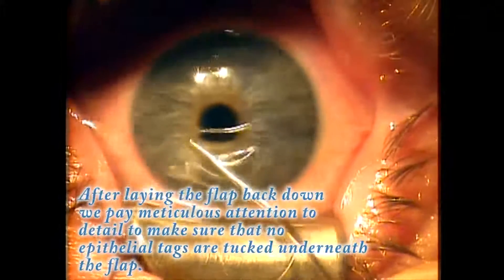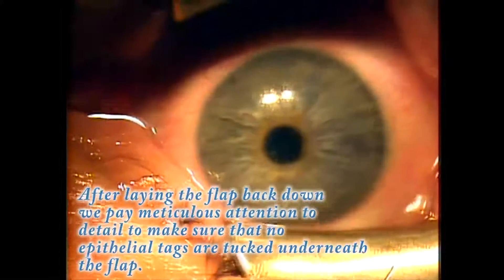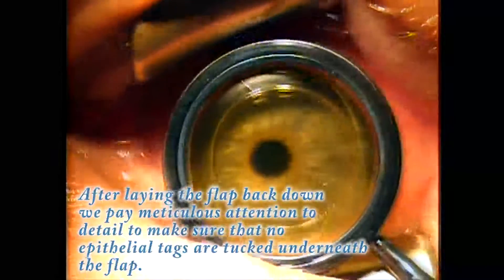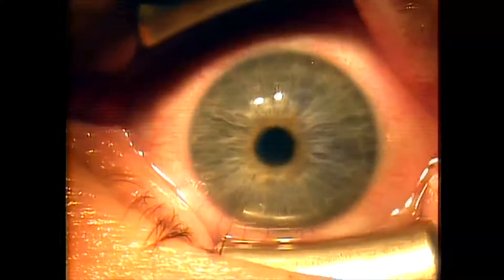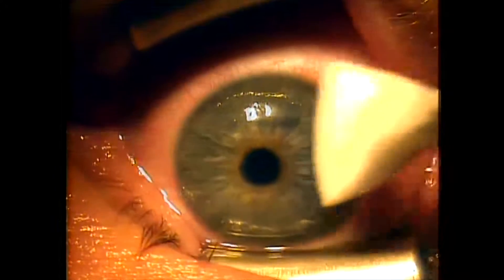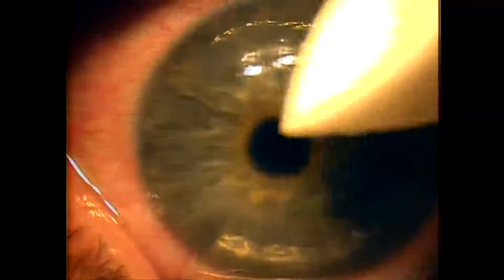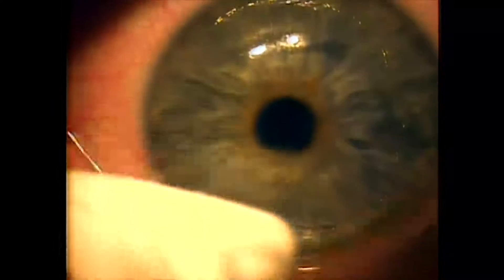One other trick I use is I'll actually tape this patient's eyelid shut so they can't blink. I'll always instill some antibiotic and non-steroidal on the eye. I do not apply steroid immediately, but I'll apply a 4th generation quinolone antibiotic and a non-steroidal like Bromday. I'll use paper tape to tape the eyelid shut so they don't blink and it puts the eye at rest, then I'll remove the paper tape 6, 12, or 24 hours later. I find that the recurrence rate is a little bit lower when I do that.